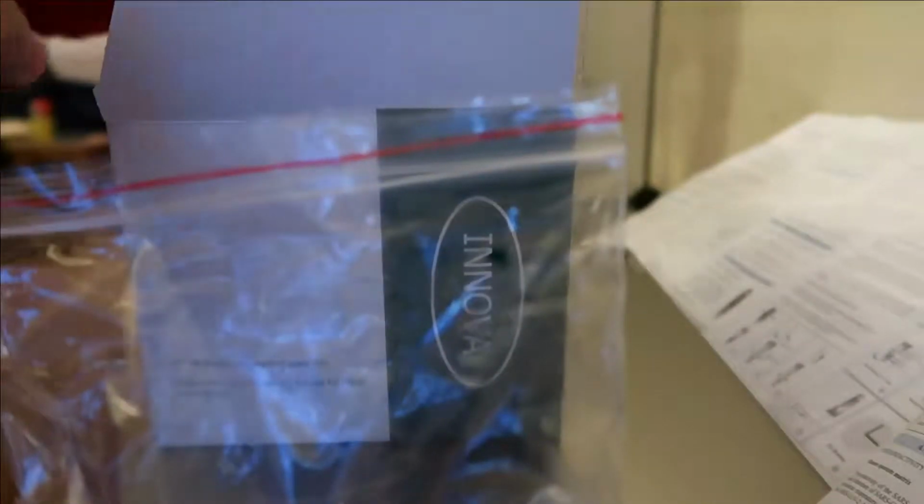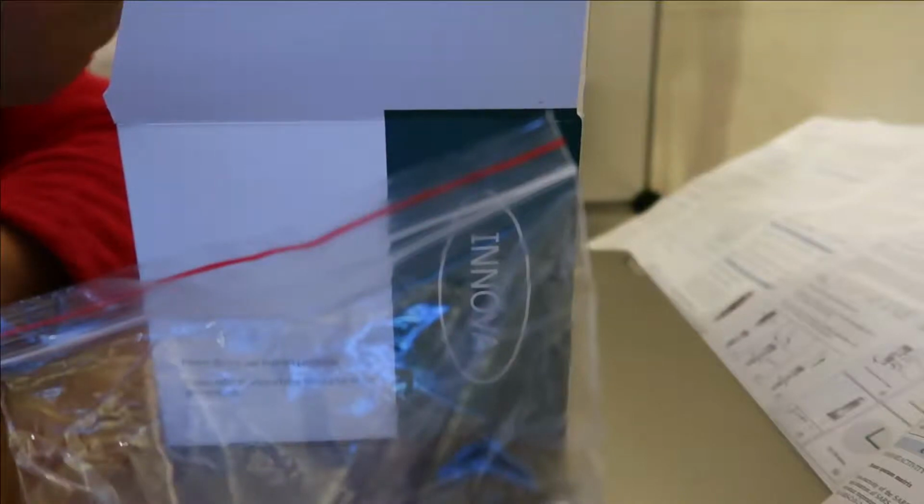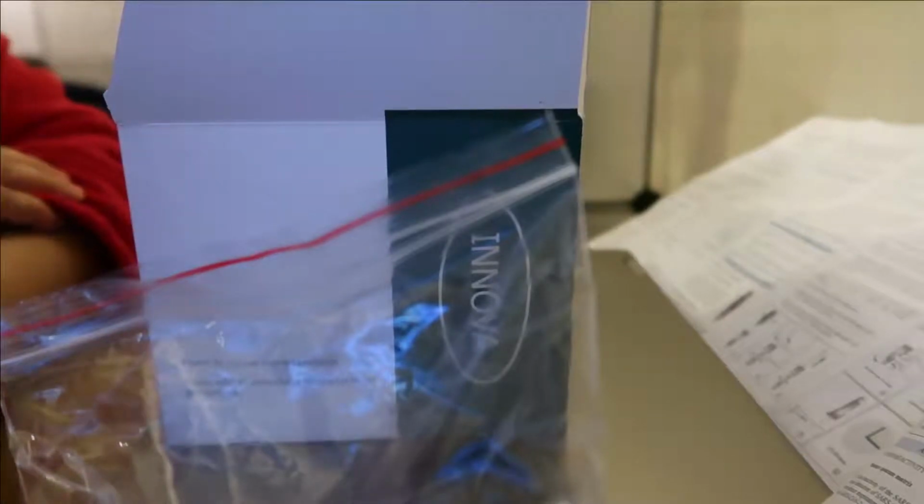Then you have the extraction solution, there are 2 here. Then you've got the instructions for use, the one that is in front, and the qualification certificate, it's inside, and you've got the throat swab or the nose swab. It's the same swab. So that's about it. When we were given training, it was in 2 parts. One is swabbing yourself, then doing the test afterwards.